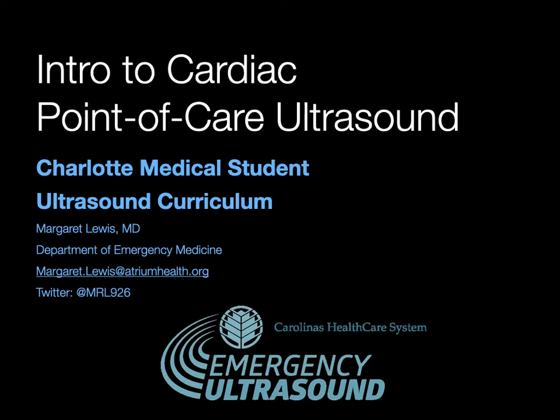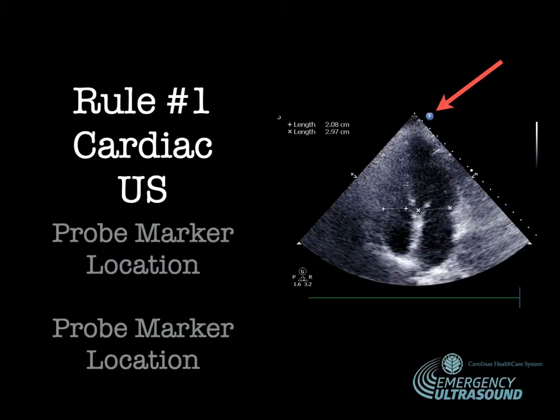Hey team, this afternoon we're going to talk about cardiac point of care ultrasound. I know that this is what you've all been waiting for, so let's get in and really get to the heart of the matter. Bad pun, yes. So the first rule with cardiac ultrasound is probe marker location, probe marker location, probe marker location.